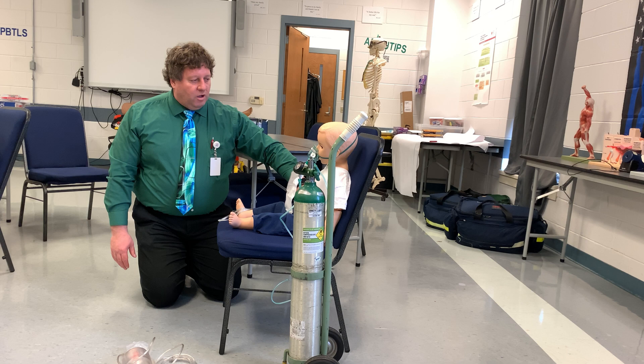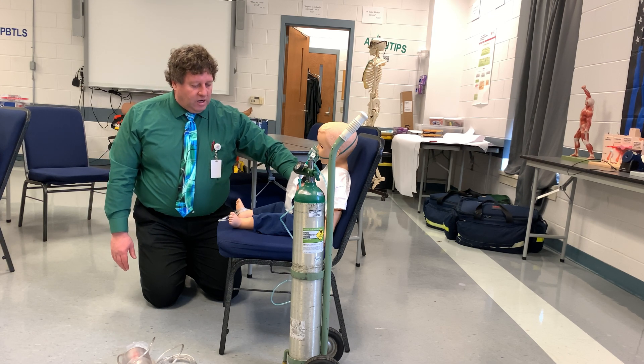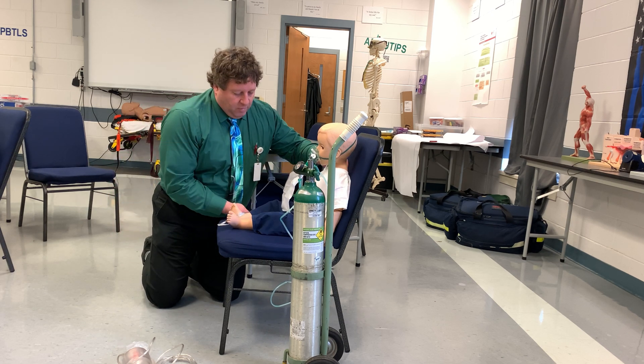I noticed that he's become less responsive, not breathing as well, and seems to be desaturating a little bit. So I'm going to have to change my non-rebreather to a bag valve mask.